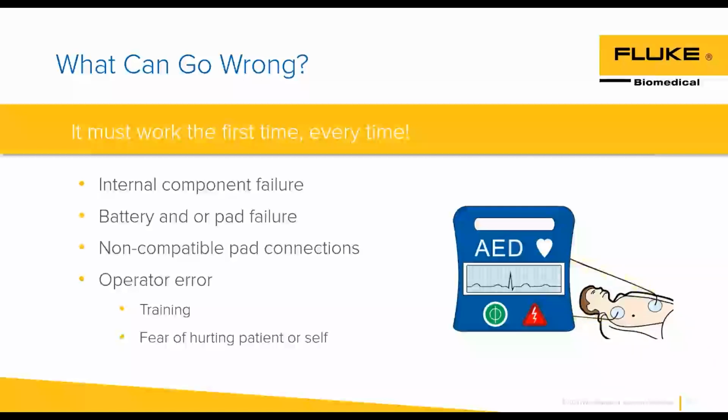And then you get to the hospital, and do they have even yet another set? Because some of these helicopters respond to multiple hospitals. So different hospitals, different defibrillators. So that pad compatibility and connections could be a big deal. So if you happen to be tasked as a biomed to advise on defibrillators, that's one of the questions we'd like to ask. Does ours marry with our local first responders?